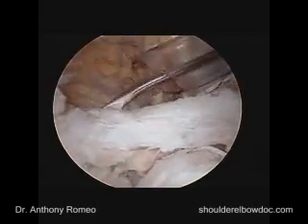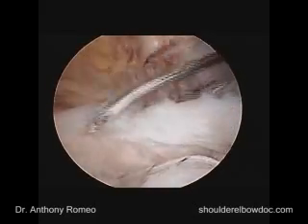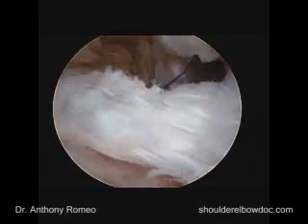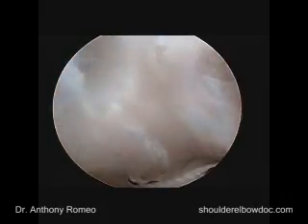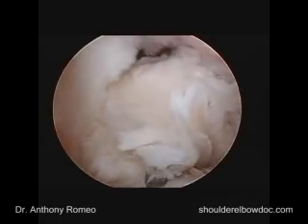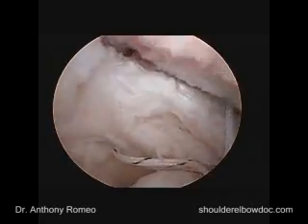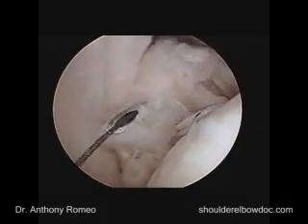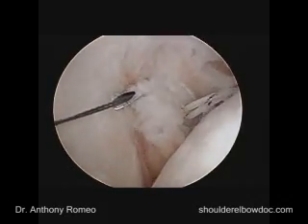We'll take our suture lasso, and again, we have to keep working back down towards our other sutures. We always have to keep in mind that medial border, that attachment point. So we want to come down close to that again, come through our tissue and out, and make sure that this is not over-tensioning the repair. We have to go a little bit medial to the capsule, but maybe a little bit less than what we just did, to again try not to over-tension our repair.